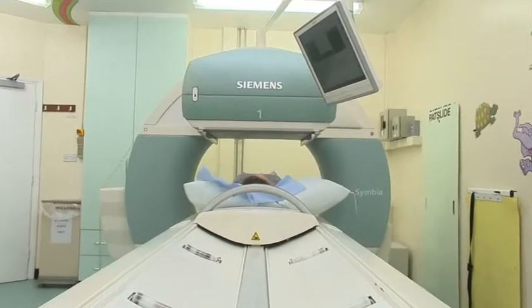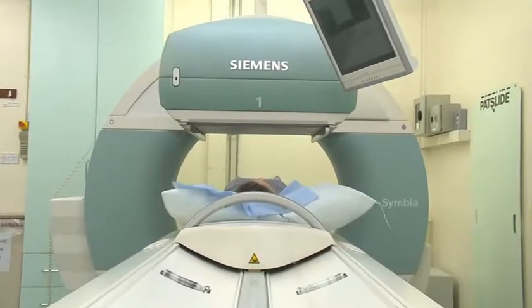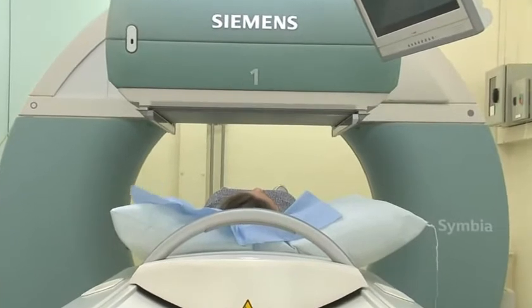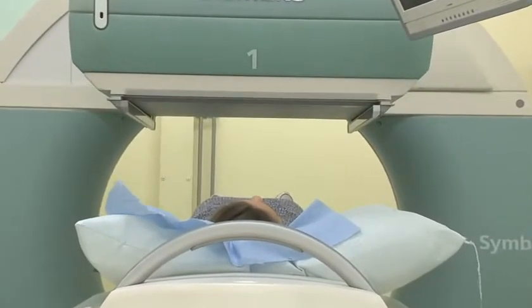A MAG3 Renogram takes 30 minutes to acquire. You have to lie very still for those 30 minutes. There'll be medical technologists in the room all the time with you, but you do have to lie still for that 30 minutes. And we've got a DVD player for entertainment.